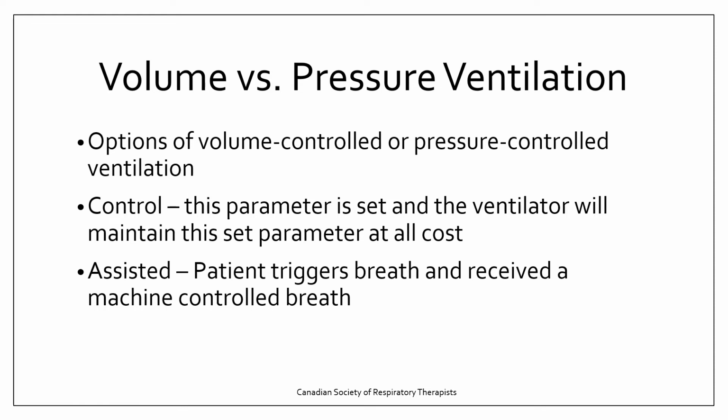And when you see control in a mode of ventilation, I want you to think that this parameter is what's set, and the ventilator will maintain that set parameter at all costs. And if a patient assists the breath, then this is a patient-triggered breath, and they're going to receive a machine-controlled breath. We could also add on there a spontaneous breath.